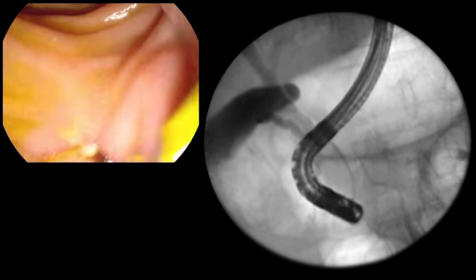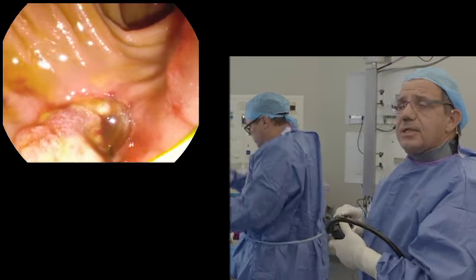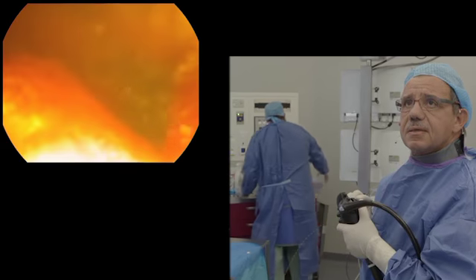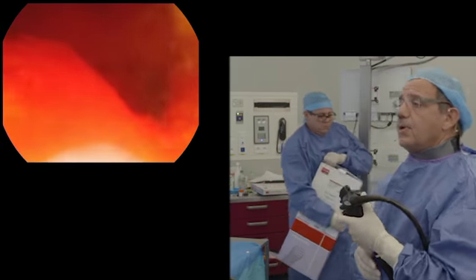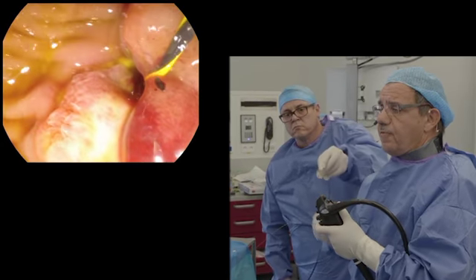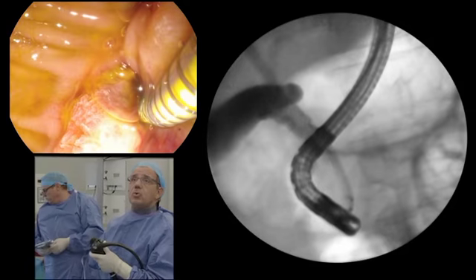Okay. I think I will use, in this case, a 4 centimeter. X-ray, please. Yes. I will use a 4 centimeter uncovered stent. Okay, now I'm as close as possible to the papilla. And you see the stent now, and the stent is in place. X-ray, it's the good dimension.